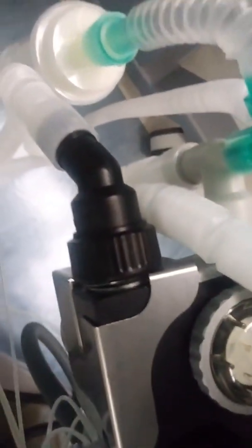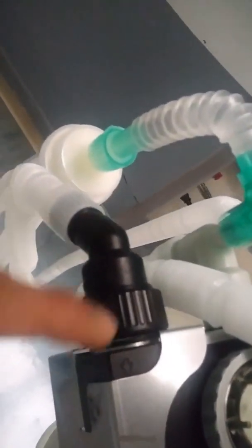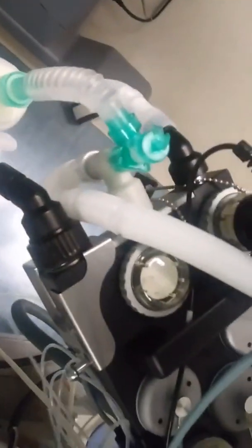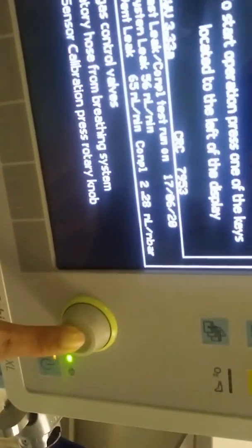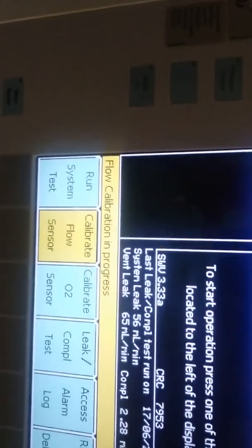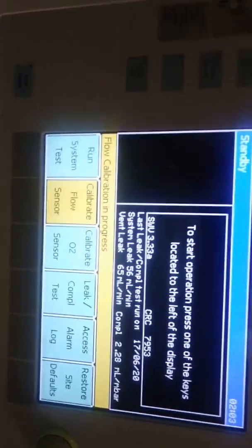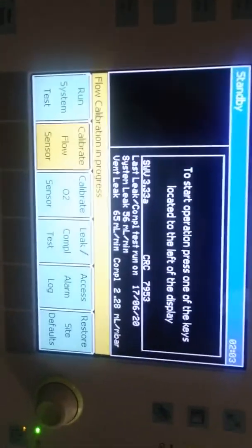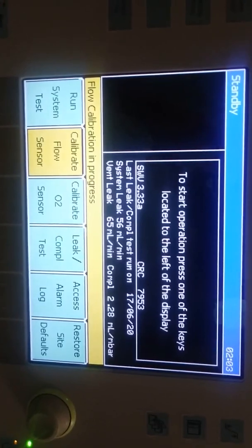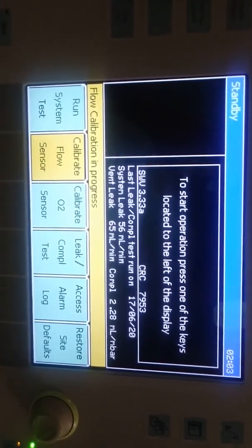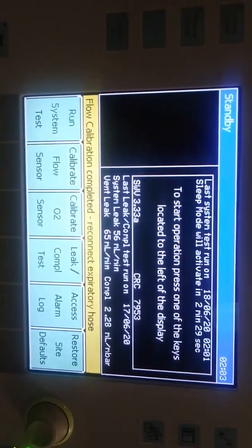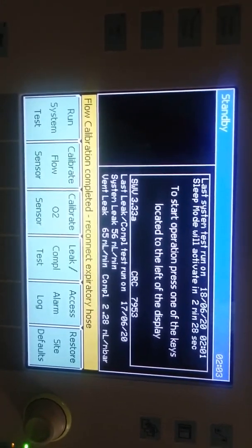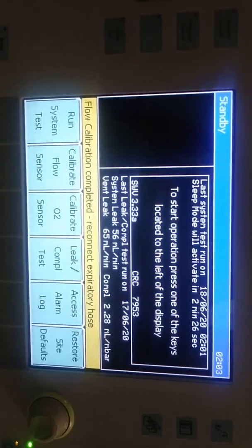Remove the expiratory limb. Third step is calibration of flow sensor is done by pressing the rotary knob. If any failure of flow sensor we can't get the exhaled tidal volume - that means we can't predict how much amount of tidal volume gets to the patient. After pressing the knob we can see the calibration going on. After few seconds we can get confirmation about flow sensor calibration completed. After calibration reconnect the expiratory limb to breathing system. Now complete flow sensor calibration.